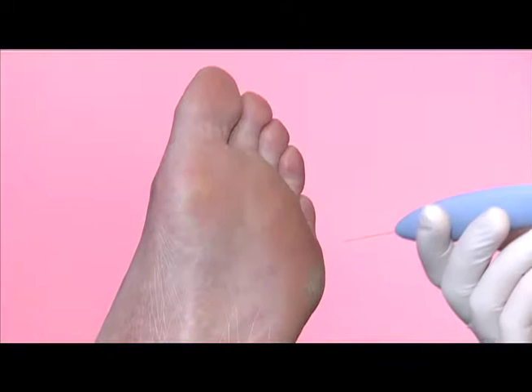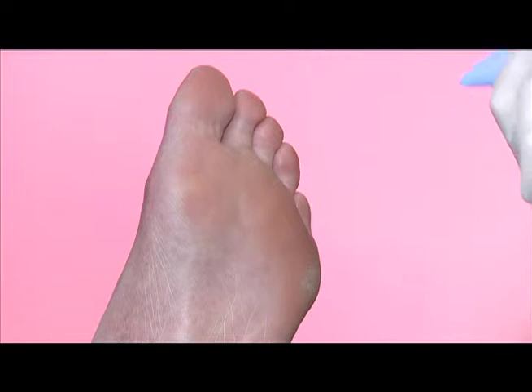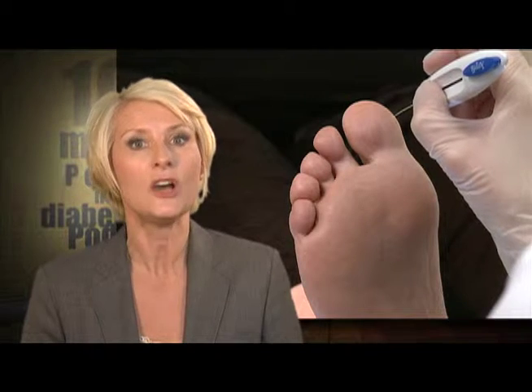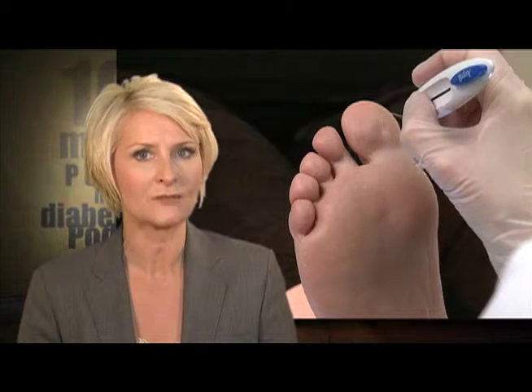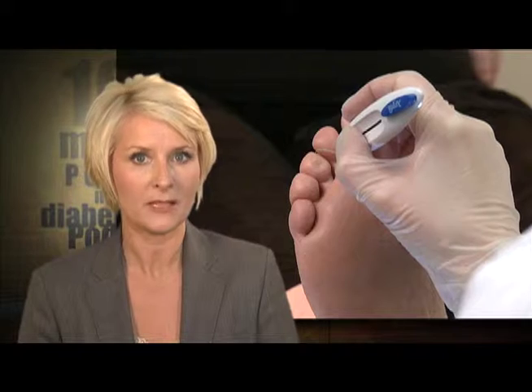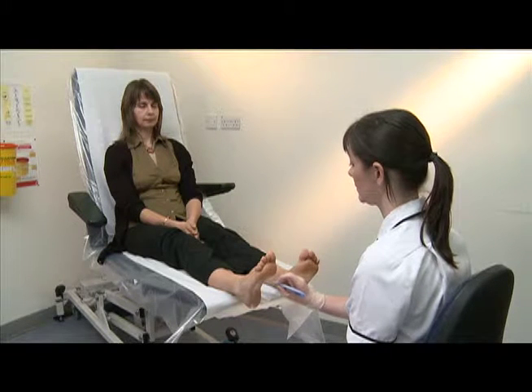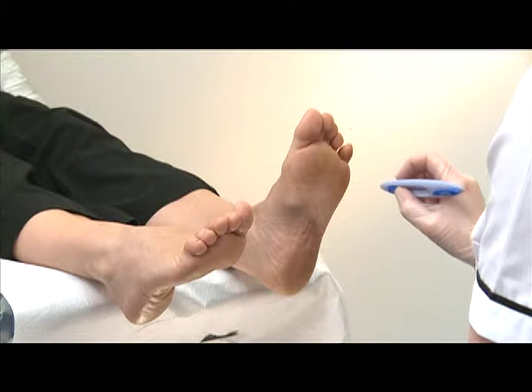Avoid testing areas on the foot where there is callus present, areas of ulceration or scar tissue. You may have to test proximally or distally when any of these are present. Do not make any repetitive contact or allow the monofilament to slide across the skin. The patient should have their eyes closed and respond yes each time they feel it on their foot. Yes. Yes. Yes. The total time from contact to removal of the monofilament should be approximately 2 seconds in duration.